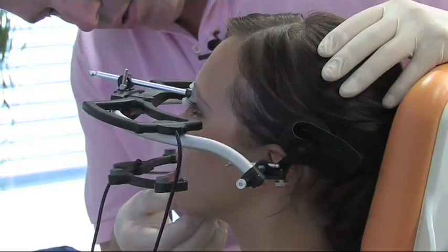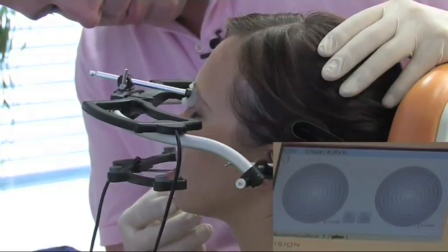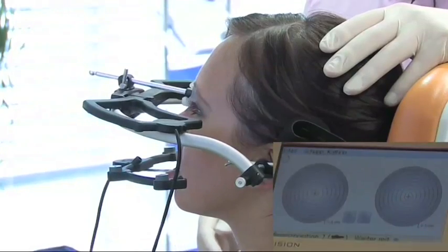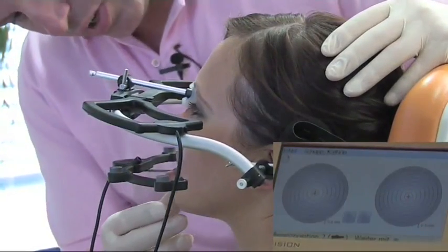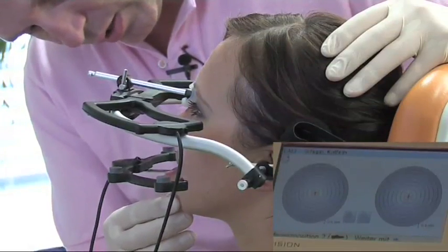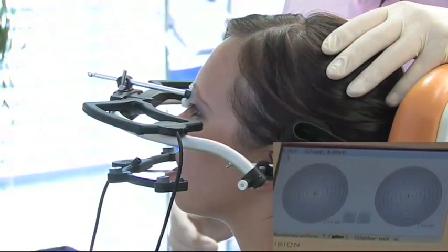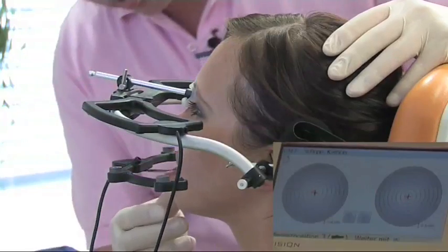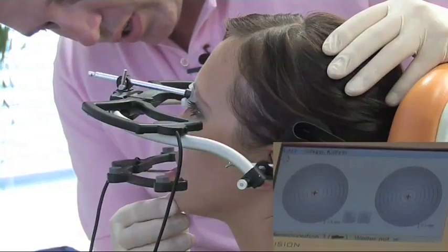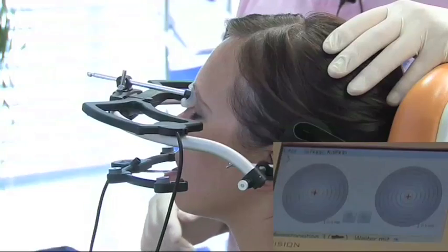Close quite slowly until the first minimal tooth contact and then stop immediately. Whenever contact is made, stop immediately. Remain so and don't do anything. Open slightly once more. Slowly close until the first minimal contact, then stop immediately and do nothing. Once again, open and close slightly until the first minimal contact. Remain so and do nothing. Everything okay?